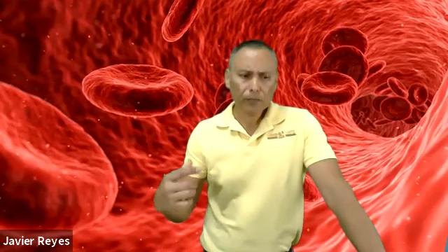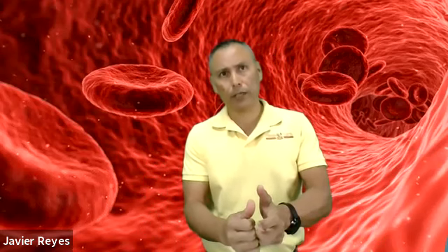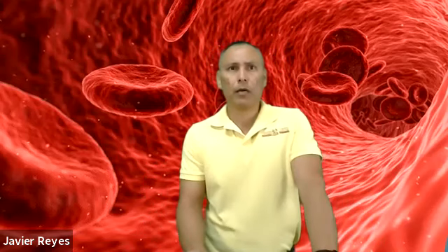The tube position. We talked about inserting the tube into the tube holder. Okay, make sure that when you push it in, you can do a twisting motion so that the tube goes in there. Okay, so be very aware of that. If the needle fails to penetrate the stopper, there will be no blood flow. Make sure that you stabilize the tube holder when inserting the tubes. All right, when using the ETS system, very important. Remember to troubleshoot failed venipuncture. The important steps: you always stop, assess the problem, and make the correction.